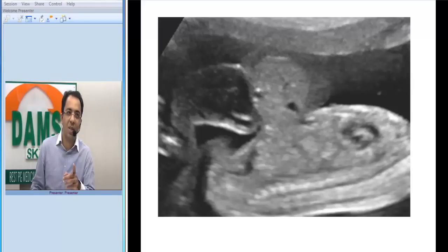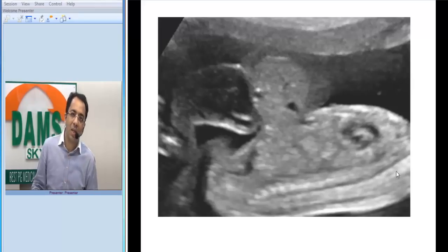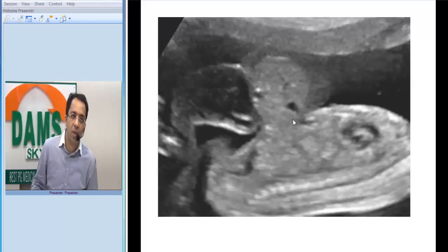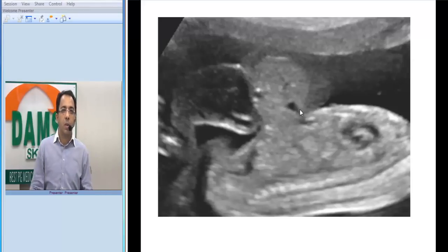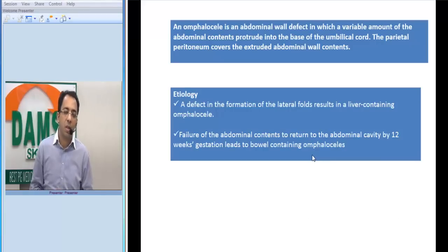This is not a meningocele. Look at the spinous process in the exam and you know we are looking at the ventral abdominal wall. This is the liver herniating out covered by the membranes. The final diagnosis is omphalocele.